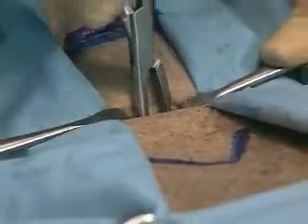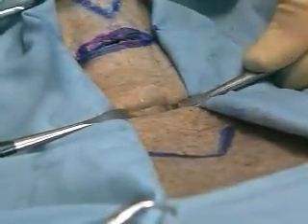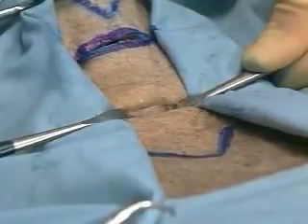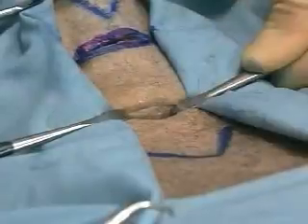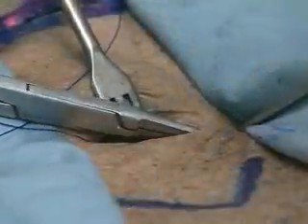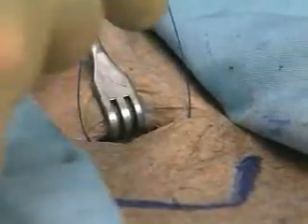The thyroid isthmus sometimes needs to be retracted inferiorly or divided. The trachea is identified and separated from the surrounding tissues, so the 2nd to 4th tracheal rings are identified. 2 stay sutures are then placed in the trachea at the approximate level of the 2nd or 3rd tracheal ring.